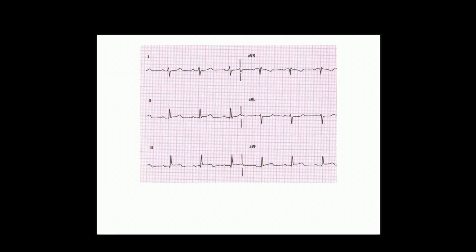What about the T wave? It's not swooping. Yeah, right. So here, this one's flattened out. This one's not too bad, but this one is really straightened out. So again, that's just a little more evidence there.